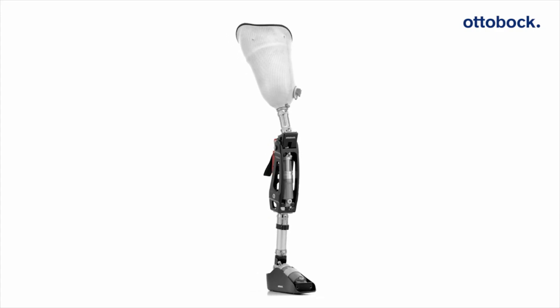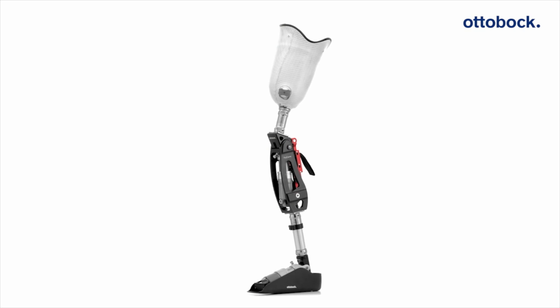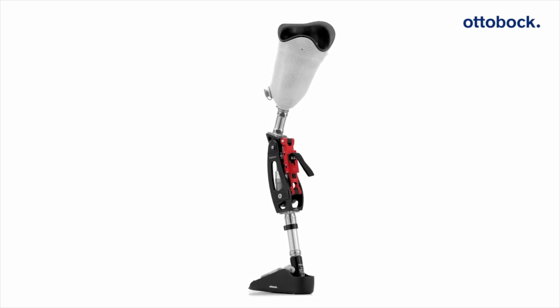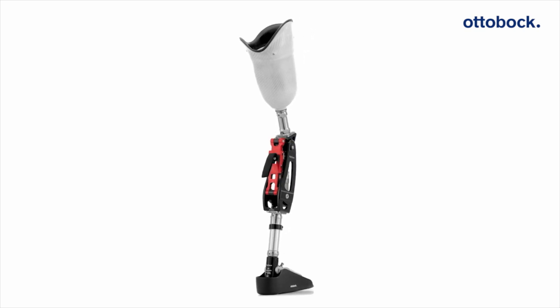The ProCarve is a sports prosthesis for recreational and professional athletes with lower limb amputations. It creates targeted support for skiing, snowboarding, and other sports with similar motions, such as wakeboarding or water skiing.